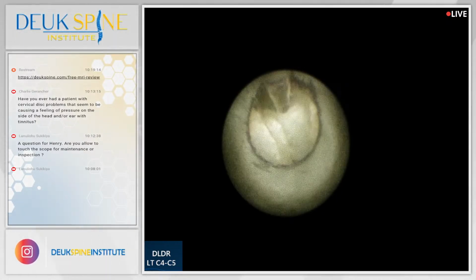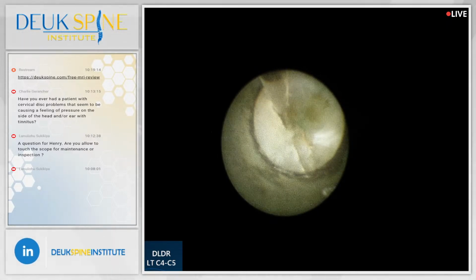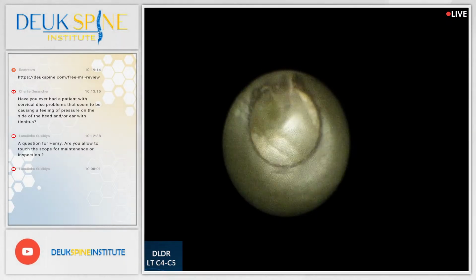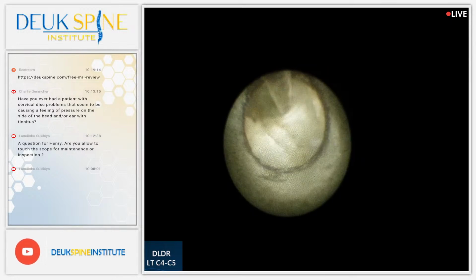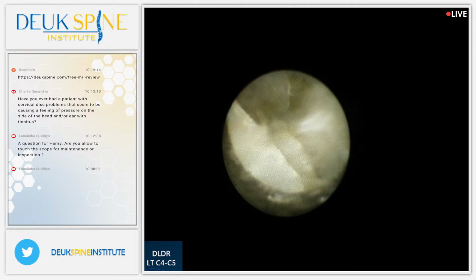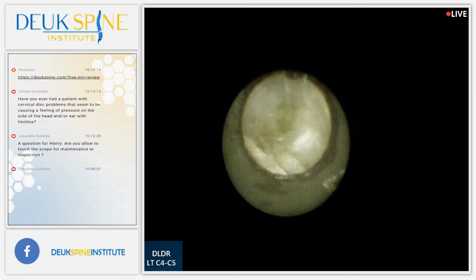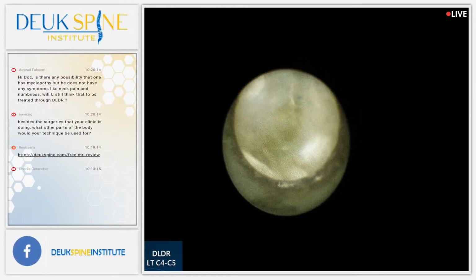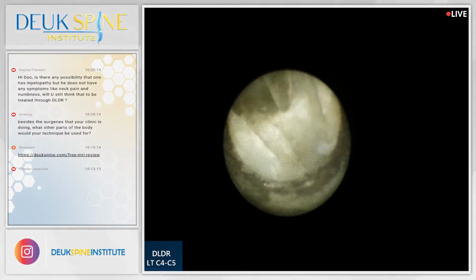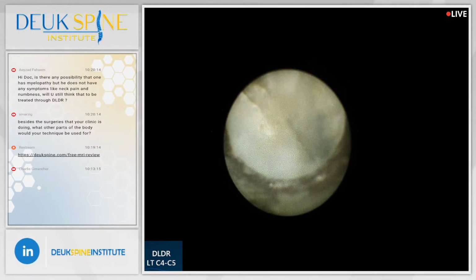All right, my God, what a herniation. By the way, see this here, the edge right there? That's the back of the vertebral body. So all this herniation is past the vertebral body, way past it. This blue stuff normally lives way up here, but there was a tear from trauma, and it squeezed out, and it's literally sitting on top of the spinal cord. And we're literally shelling it out, just a millimeter, not even a millimeter, a 20th of a millimeter at a time. So I got to remove more of the PLL over here.